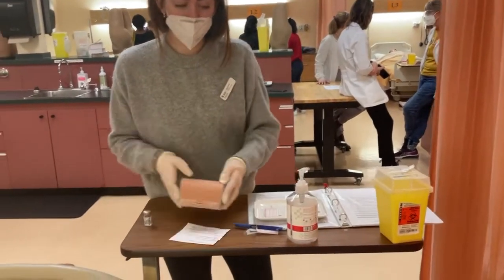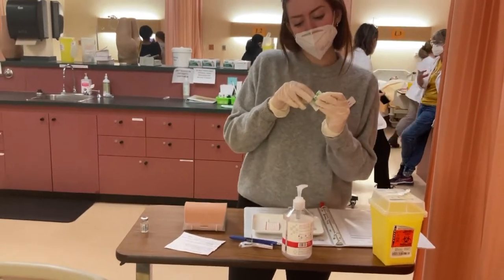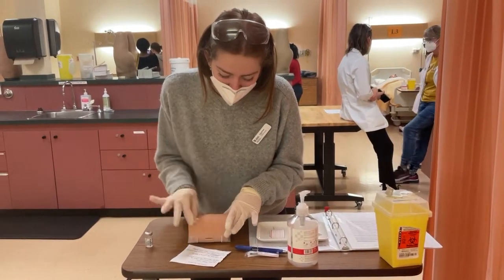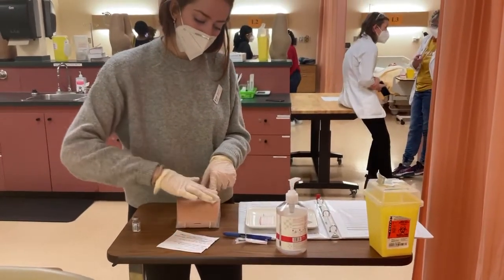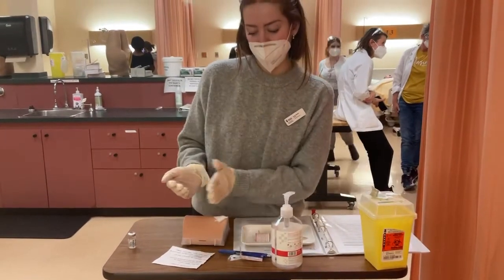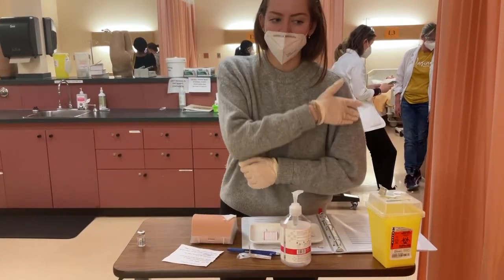So this is Jake's arm. I will sanitize for 30 seconds in a circular motion. I'll let it dry for about 30 seconds and make sure I landmark with my medication. So for intramuscular injections, you do a Z-track method. That is by pulling the skin taut, injecting. Once you remove the needle, you let go. That lets it disperse better in the muscle, kind of making that motion, and so it does not leak out of the arm as well.